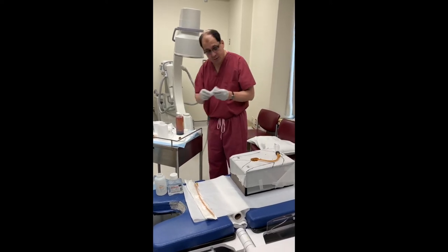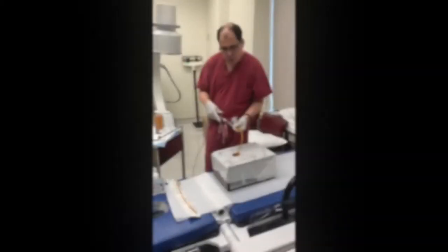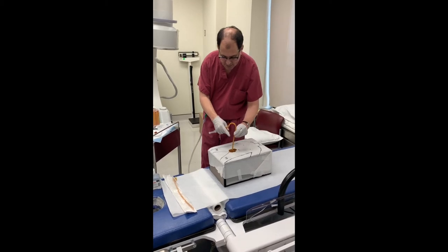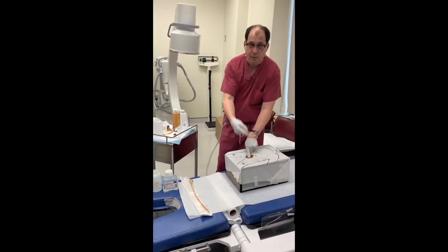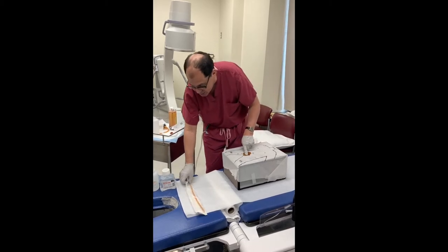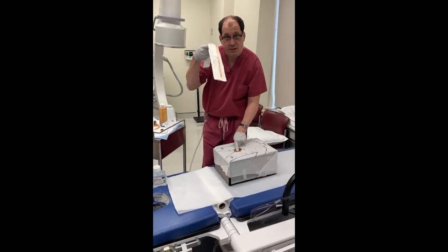Get your syringe and deflate the balloon — and you have to get ready. Because when you take the catheter out, it's going to be like a finger in the dyke. You'll see urine start pouring out of the hole, so you have to be prepared. I have the catheter already opened in the package, but I don't want to touch the tip of the catheter.